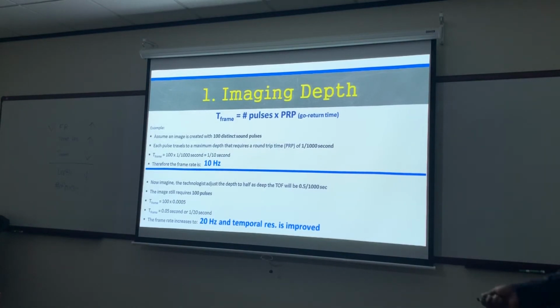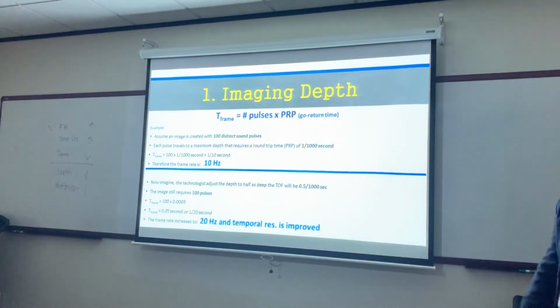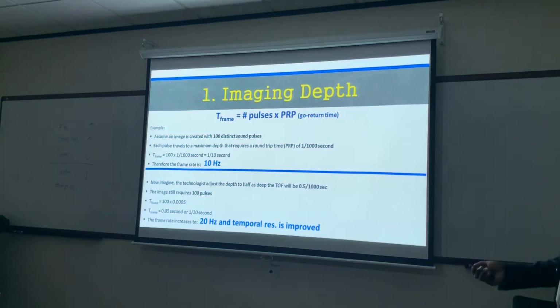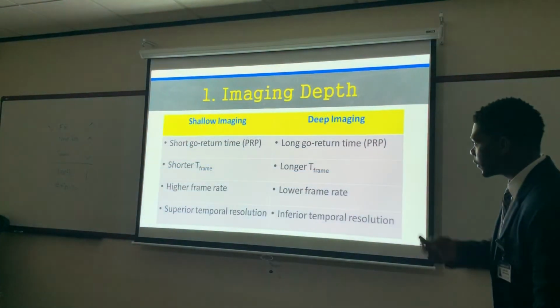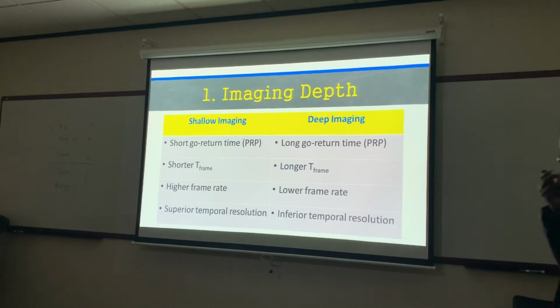Okay. I don't know if I'm going to give you any problems like that on there, but it may be, depending on if it's like a word problem. Now you may have to figure out what the frame rate is or what's the T-frame. Right. So when we talk about shallow imaging, guys, concerning imaging depth, that's going to be a short go and return time.